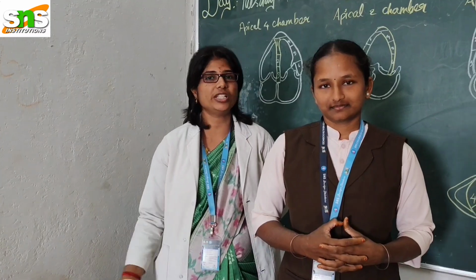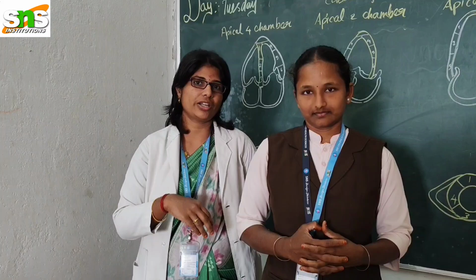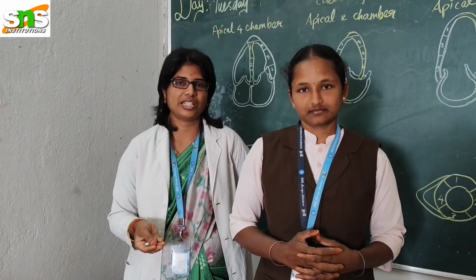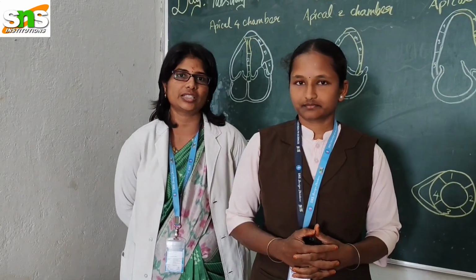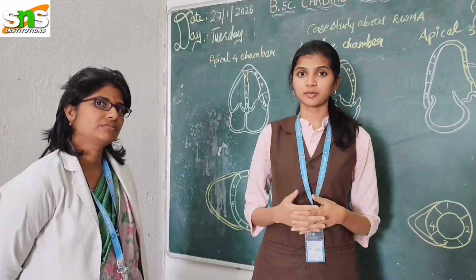So occlusion of coronary arteries leading to ischemic heart disease can be detected using echocardiography. For more sick or bedridden patients we do a bedside echo, and for stable patients we can use a normal echo to detect which segments of the LV are affected and which artery is occluded. So I'll be presenting the patient's profile.